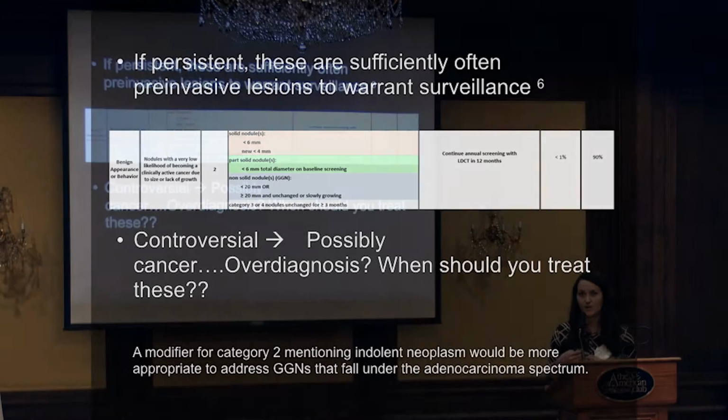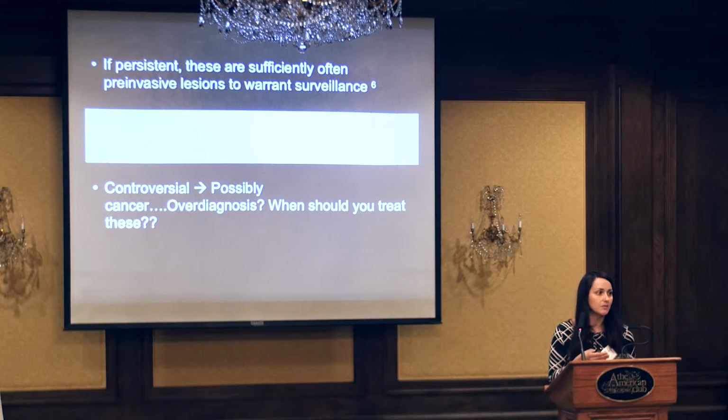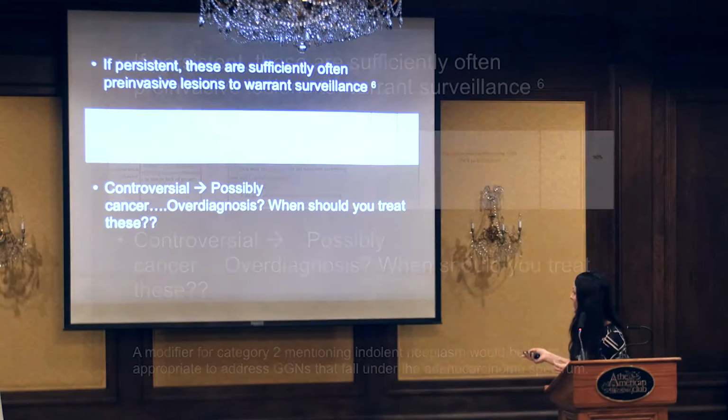Patients are probably going to die with them rather than from them. And we pull the trigger when we see changes. Since they grow very slowly, you should always try to compare it to the CT scan that you have farthest away, not just the prior, because it's going to be hard for you to notice the changes in these nodules since they grow so slowly.